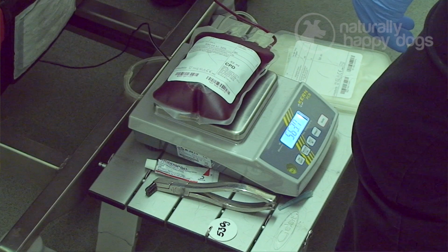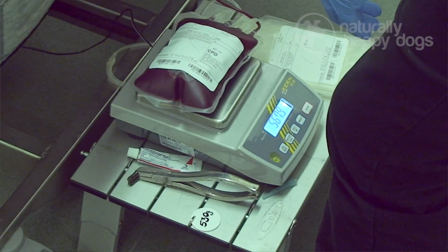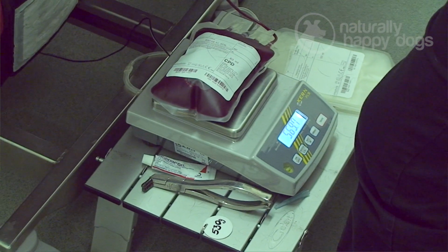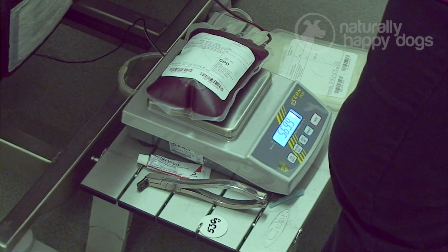The whole blood is collected, 450 ml, and that is divided at least into 2. So we centrifuge it down, the red cells move to the bottom of the bag and the plasma remains at the top of the bag. Within that closed collection system we're then able to remove the plasma into a whole unit to help 1 dog, or into 2 half units to help 2 small dogs. The red cells then have a red cell nutrient added, and that unit is then stored as a whole unit, or once again it can be divided into 2 to help 2 small dogs.